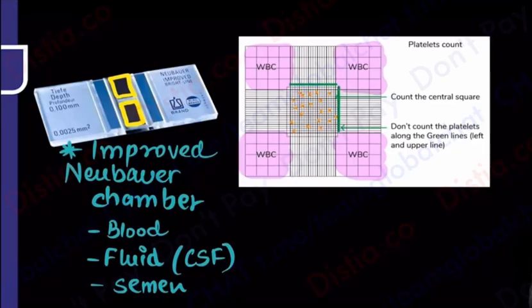I'll show you a bigger picture. The red blood cells are going to be counted in the central grid, but not everywhere in it. It is counted in the peripheral 4 small boxes and the central 1 small box. So red blood cell is counted in a little complicated manner. Repeating, the white blood cell is counted in the 4 big peripheral boxes, and red blood cells are in the center, the 4 peripheral small boxes and the central small box. So red blood cell done, white blood cell done.